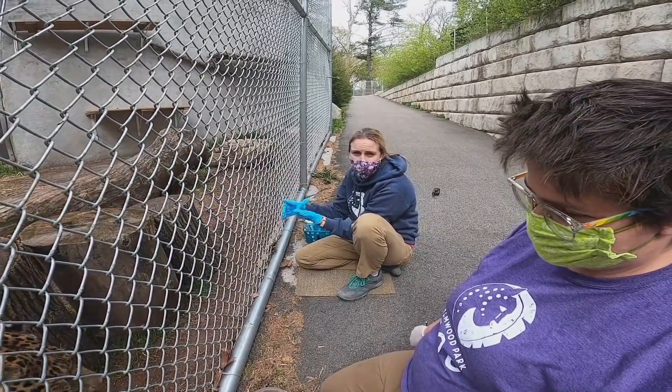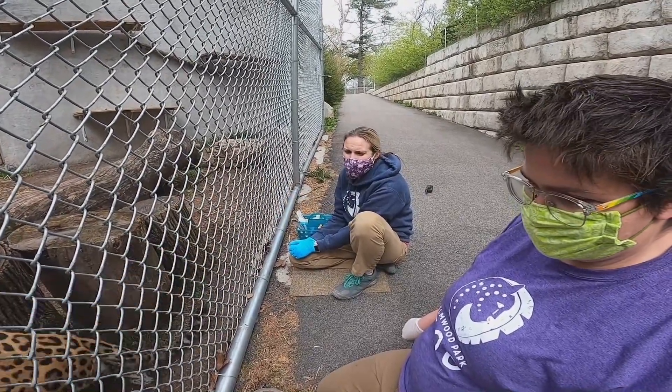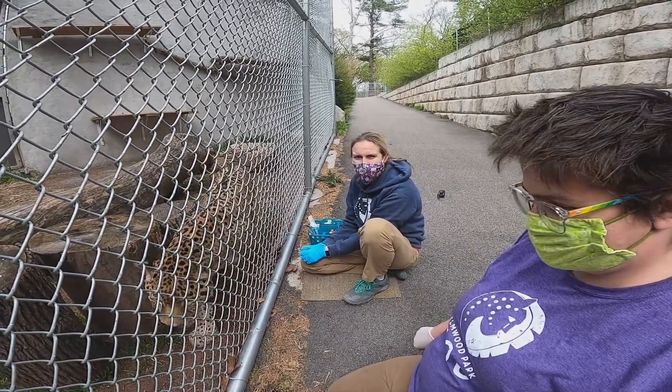He is allowed to leave this area at any time, so he does it all through choice. We do it through positive reinforcement, and that's how we're able to get blood on all three of our jaguars. So we'll see if Zian wants to work with us today.